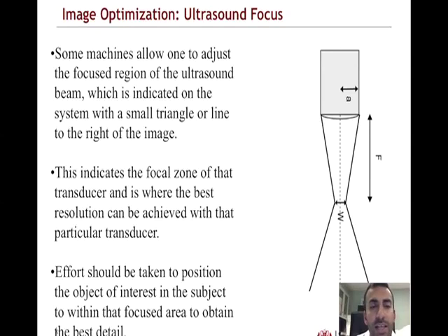The concept of ultrasound focus is essentially a method in which you tell the ultrasound machine to allow the ultrasound wavelengths to be the most linear up to that area of focus. This is important because fundamentally, as ultrasound gets emitted, it will no longer follow that linear pattern, and may sway in one direction or another.